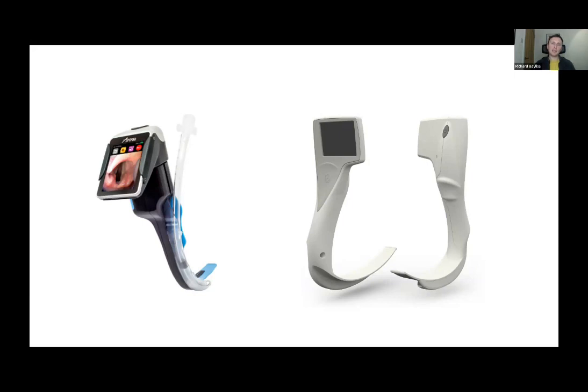The optics, as you'd expect with a disposable device, are not quite the quality of some of the more expensive devices. But I think its main drawback is that its action is completely different from a standard geometry laryngoscope. So if you insert it and get a good view, then that's great. You can stick the tube in as well. But if you don't get a good view, then optimizing your view, if you've not used it very much before, is going to be quite challenging, just because it is a completely different action from a normal laryngoscope.